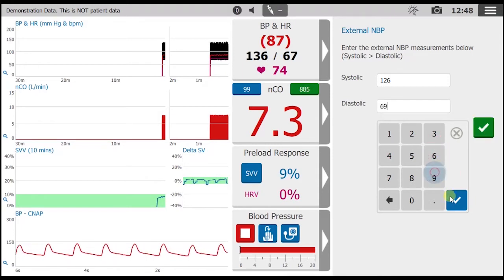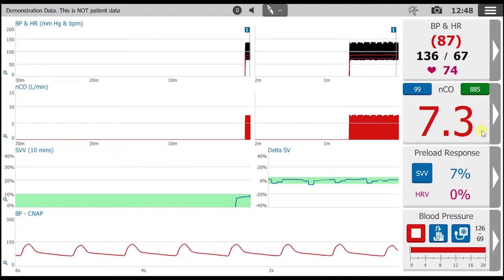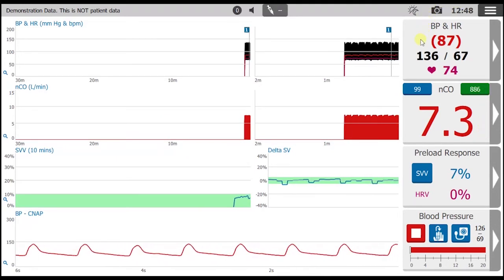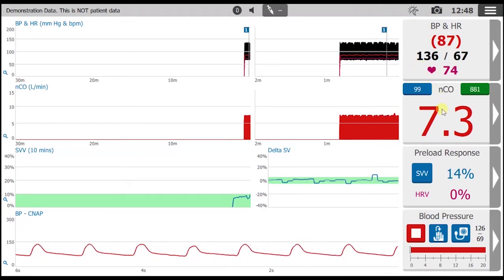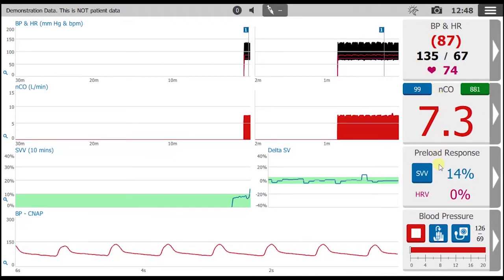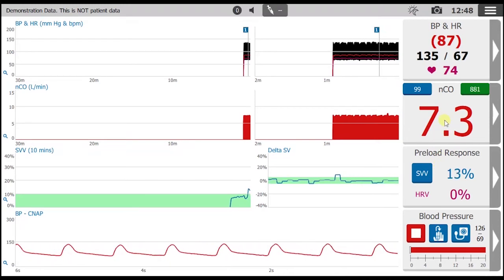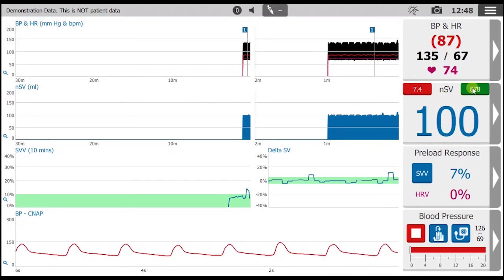That's it for the setup. Now our PulseCo algorithm will analyze the arterial waveform to provide continuous non-invasive blood pressure, advanced hemodynamics, and guidance regarding fluid volume responsiveness. Here the cardiac output is shown in red, stroke volume is shown in blue, and systemic vascular resistance is in green.